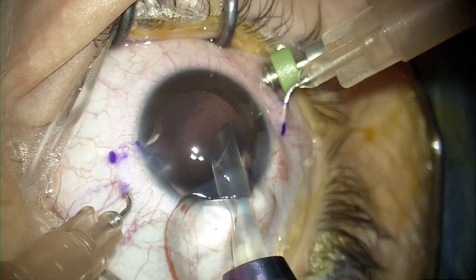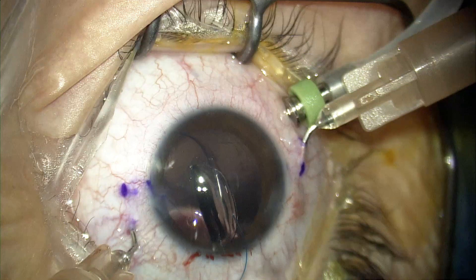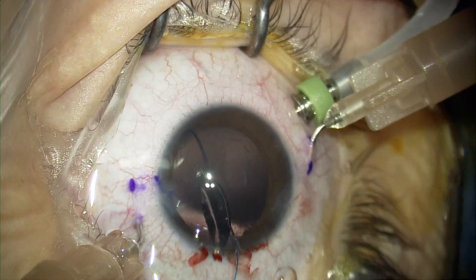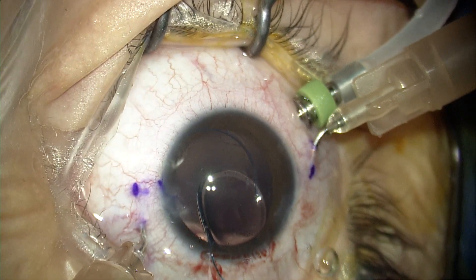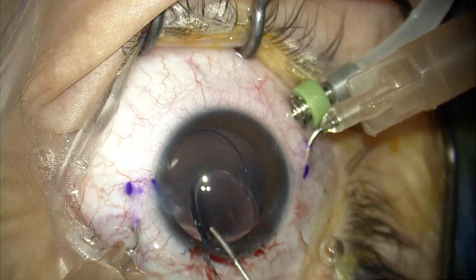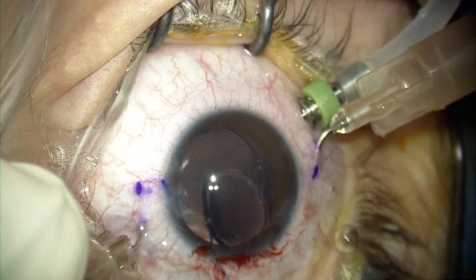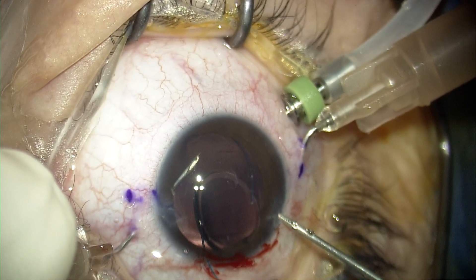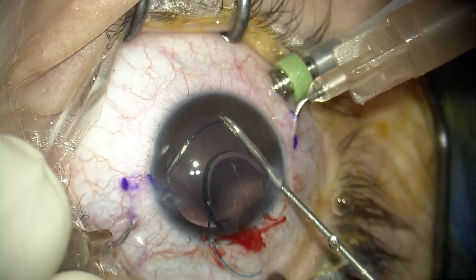The lens we use is the Johnson and Johnson multi-piece IOL. It's not really the ideal IOL for the Amani technique, as the haptics are rigid — unlike the lenses classically described by Dr. Yamani, which usually have more malleable and forgiving haptics. The problem with the Alcon and Johnson and Johnson multi-piece or three-piece IOLs is that the haptics are very rigid; any excessive maneuvering, moving, grasping, or bending of the haptics can cause them to break.